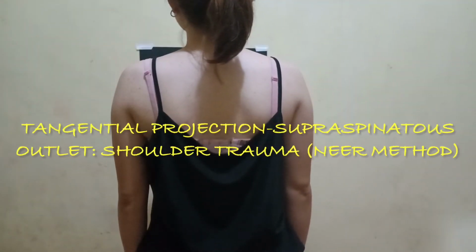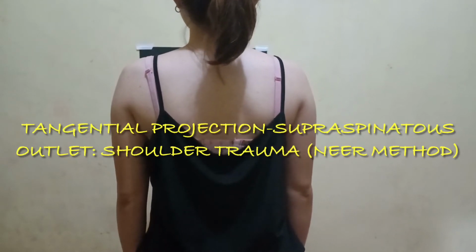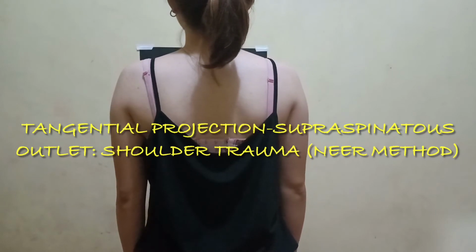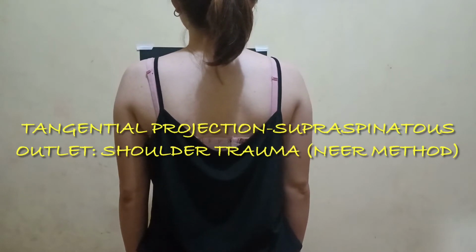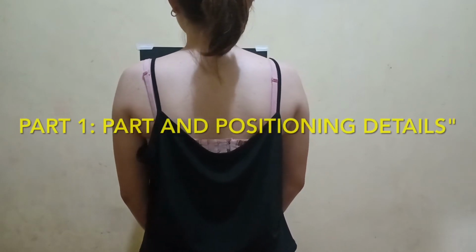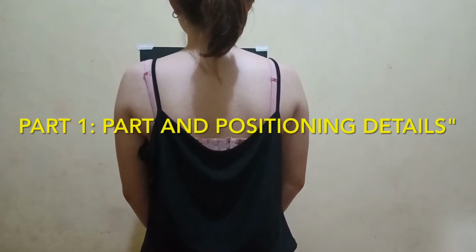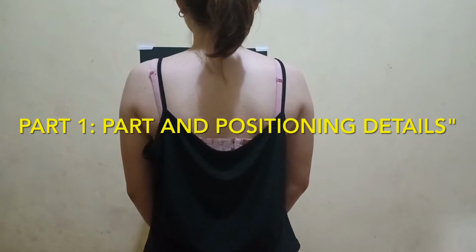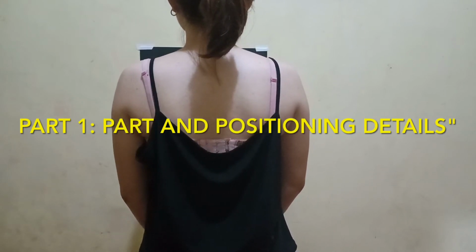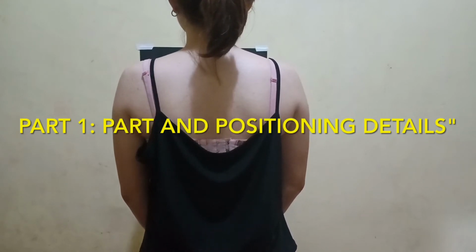And the next radiographic examination that I am going to demonstrate is the tangential projection supraspinatus outlet of shoulder trauma, also known as the Neer method. For its part 1, the part and positioning details of the patient body. The first thing is, when taking the radiograph, the patient should be in an erect or recumbent position, just like what the patient is doing right now. The erect position is usually more comfortable for the patient.